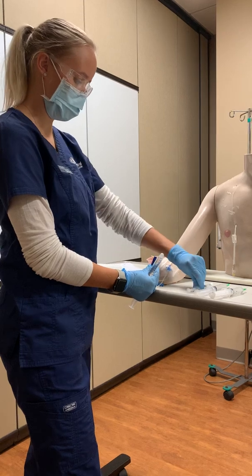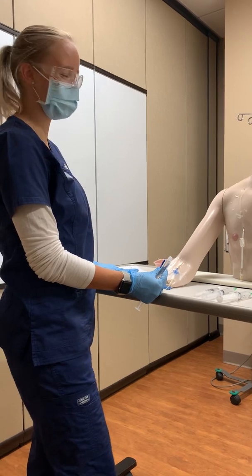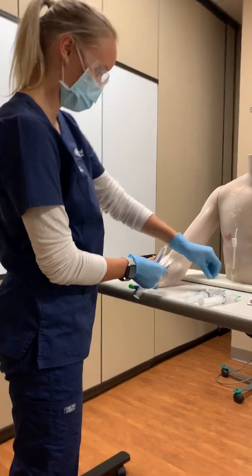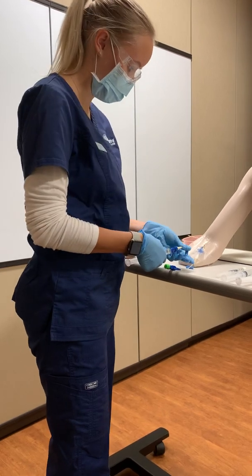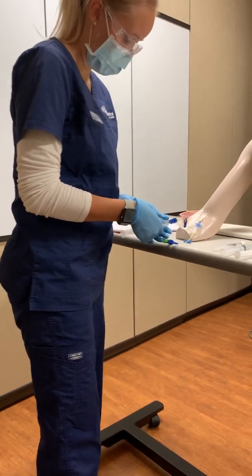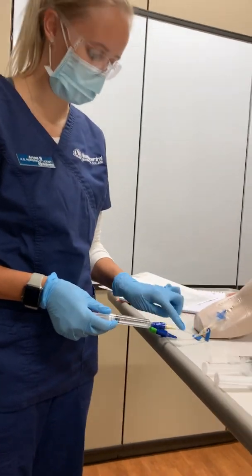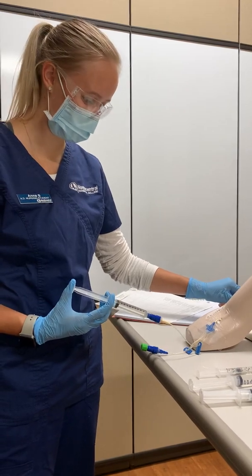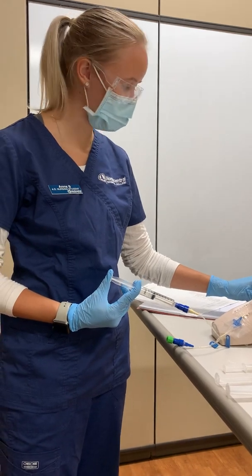Zofran, according to the medication administration book, does not need to be diluted. So take off the cover. Already alcohol wiped it. Unclamp it. And then I would pull back a little bit just to make sure that the line is patent and that there is blood in there, which there is. So then I can inject the normal saline to clear the line.